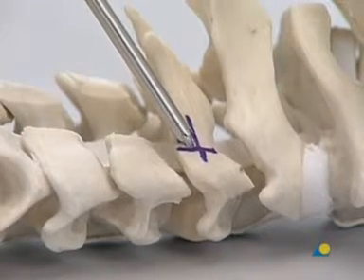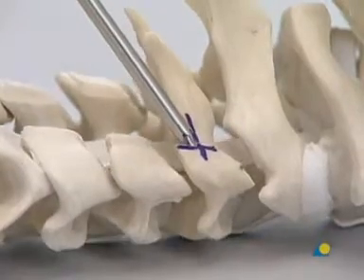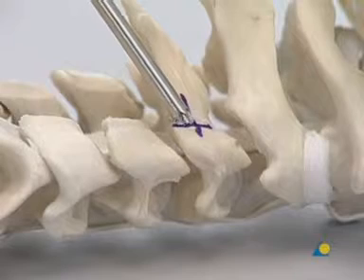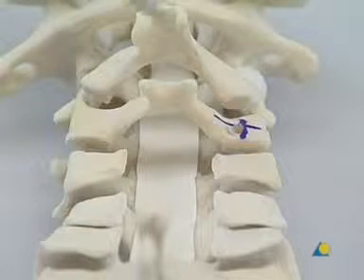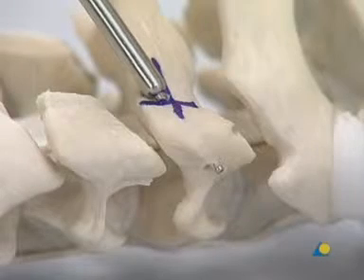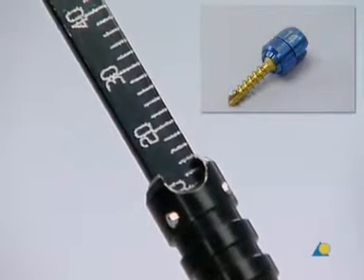The exit point of the drill is shown. Although with the Axon system, it is not always necessary to perforate the opposite cortex of the lateral mass. The length of the screw is determined using the depth gauge. The reading on the depth gauge corresponds to the length of the screw needed.